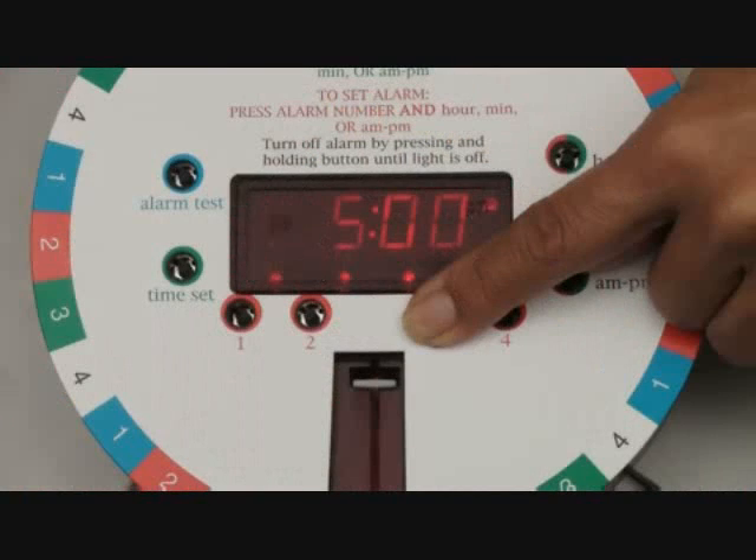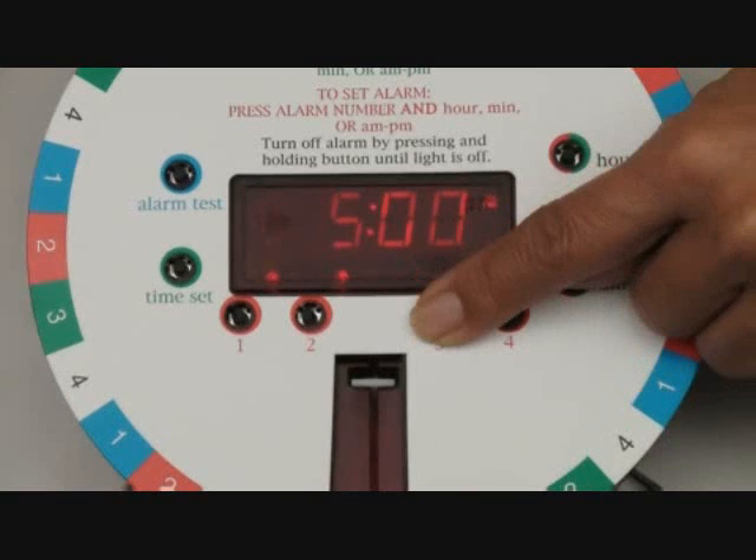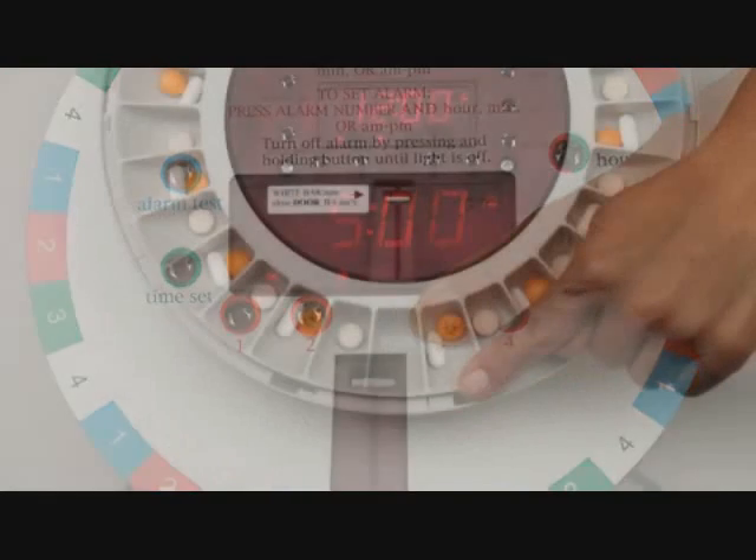Turn off unused alarms by holding the button down until the light turns off. In this case, we're going from three active alarms to two. To turn an alarm back on, simply hold the button until the light comes on.